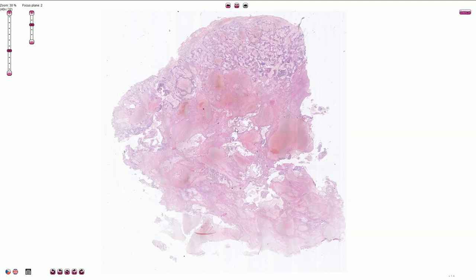Choriocarcinoma is usually a very hemorrhagic and necrotic tumor. That's what we see here, and only in part of the slide we see viable cells.